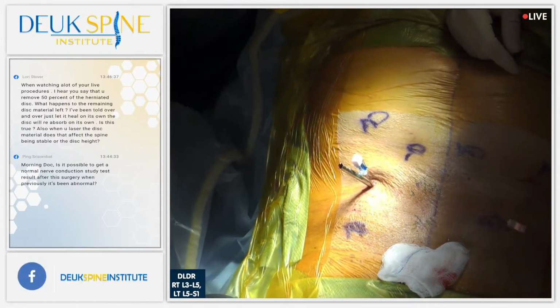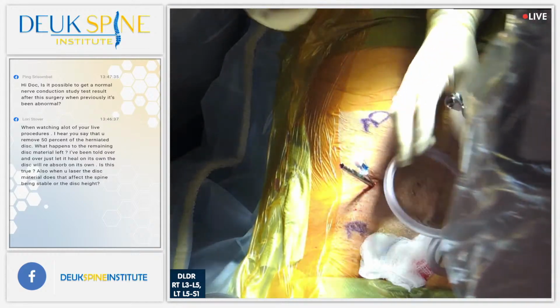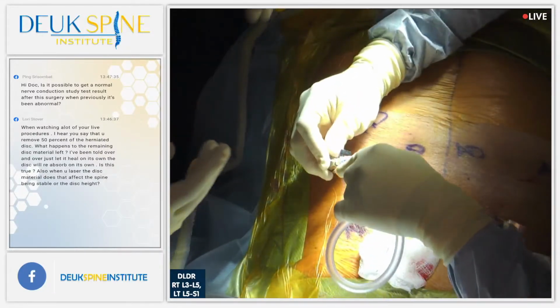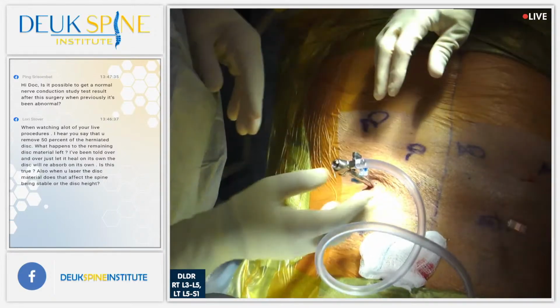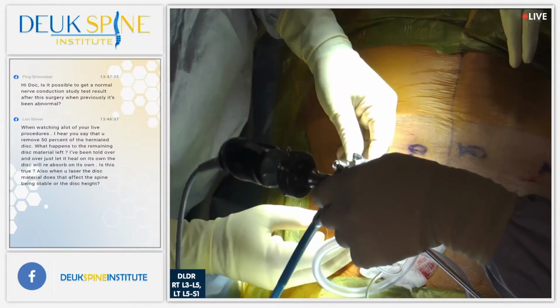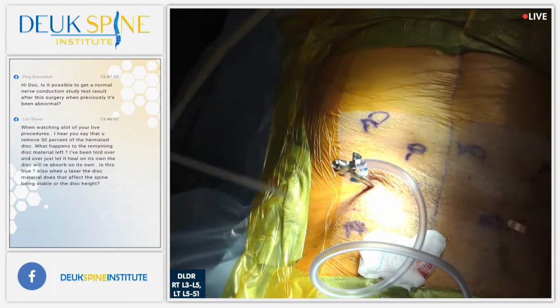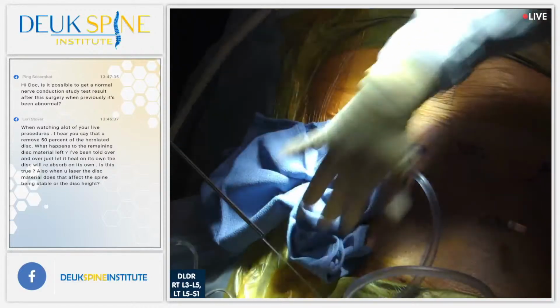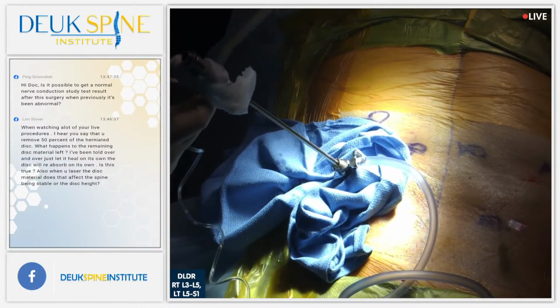Well, the video you just saw explains why an injured disc in the spine can cause so much pain. Turns out that 85% of chronic back pain is due to injured discs. And we are now going to go in and repair that disc using a special laser and an endoscope. What we're going to do is clean out the tear in the back of the disc.